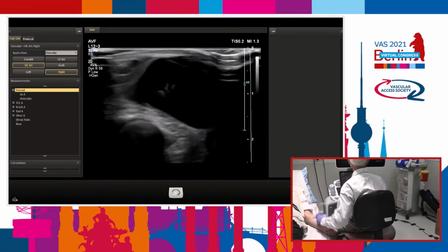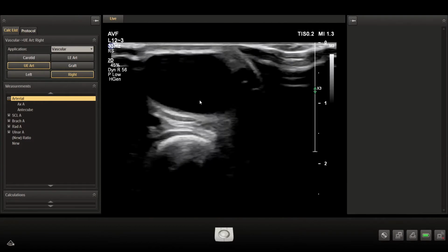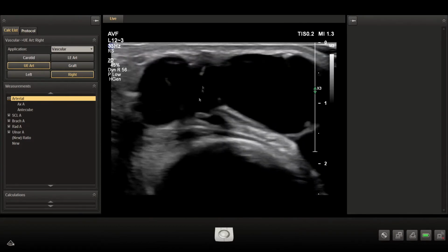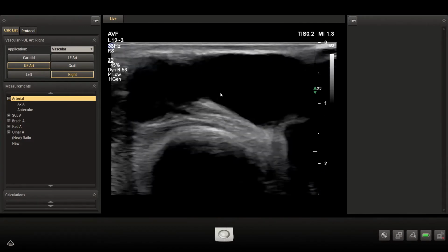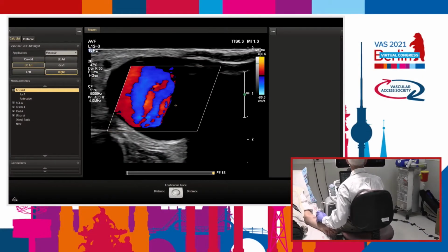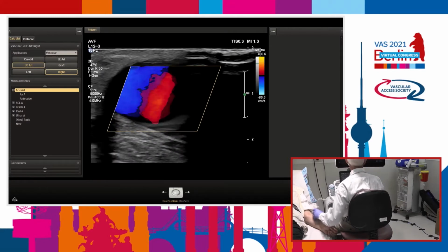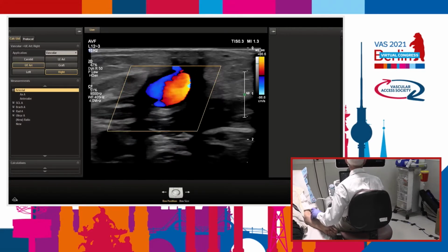Again, we can take it in grayscale. You can see some calcification in valves in the vein, but they are insignificant here. You can see it over here also. Probably this is an old valve, and this is the puncture site here. You can appreciate the high flow in the fistula. We soon will measure it. The diameter at the arterial puncture site is 19 millimeters, and this is the venous site, well developed. And we continue with the transverse view.